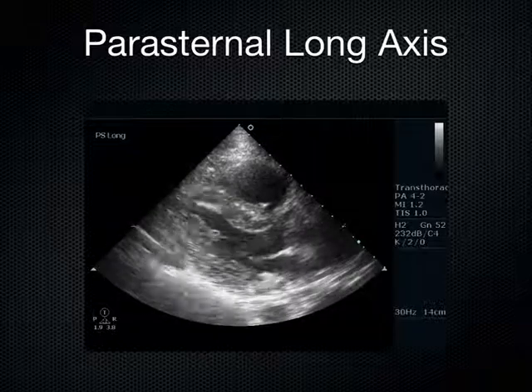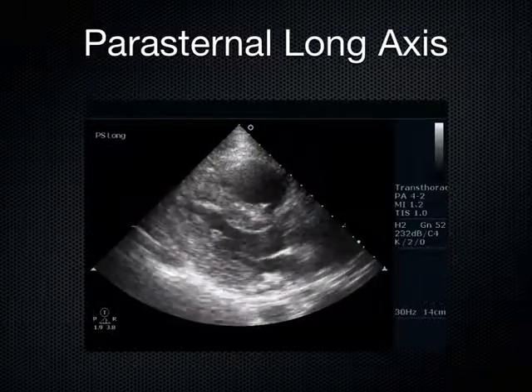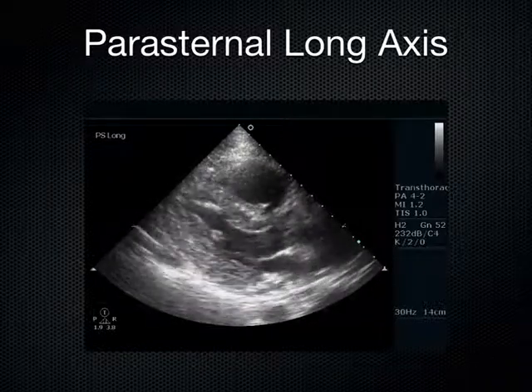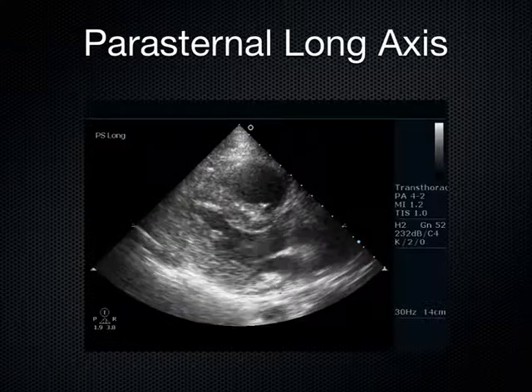What do you think about this heart right here? First question that comes to my mind, I look at this heart, I look down at the patient, and I'm like, are they dead? Does this patient have a pulse? Because this heart is really not looking good, right?